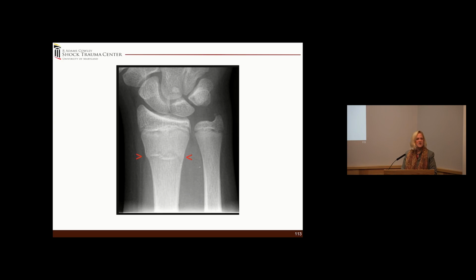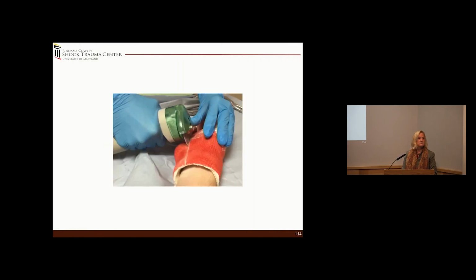So afterwards, it's perfectly set, everything looks good, okay? So what's the next step? Cut the cast off, right? Why not? My bones were set, right? I mean, it's in alignment, everything looks good. This is the analogy of a broken lung. It is not necessarily ready to completely come off of airway pressure, right? You are still pressure dependent.